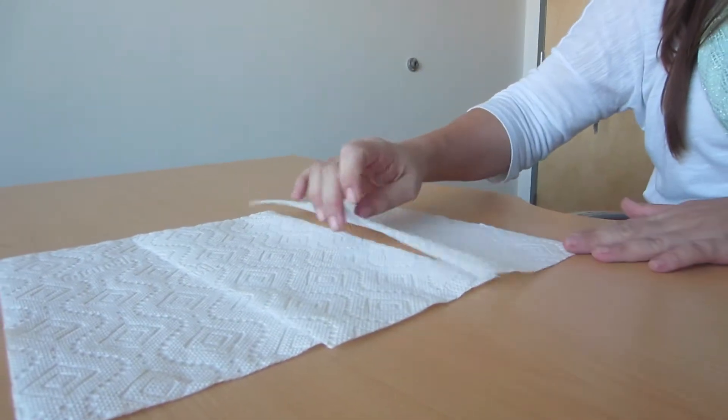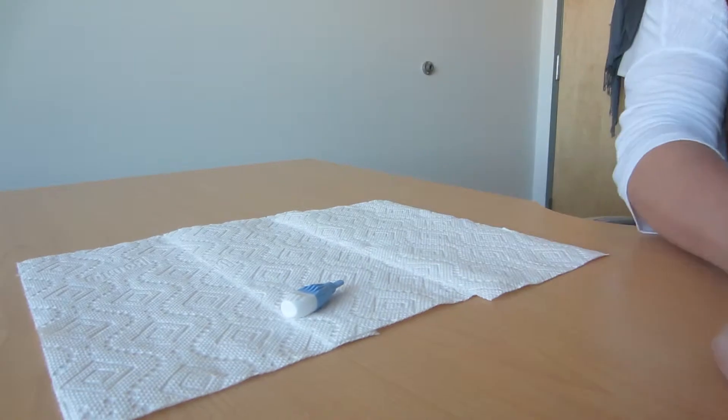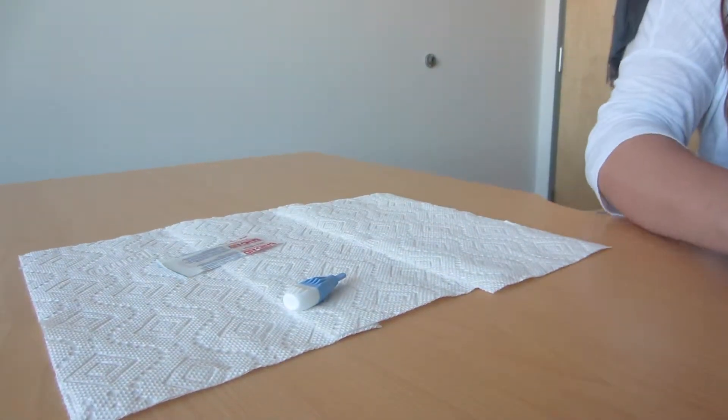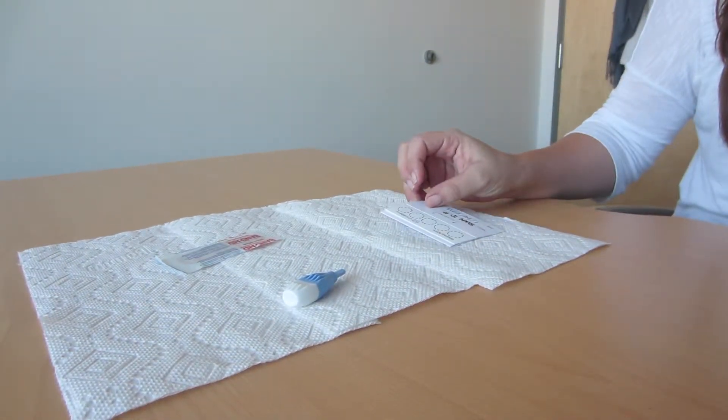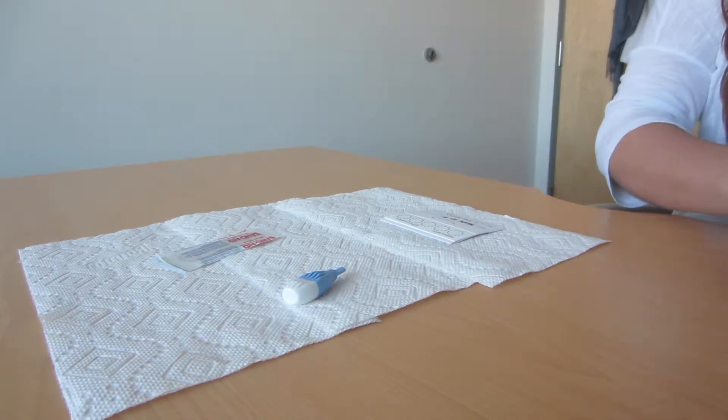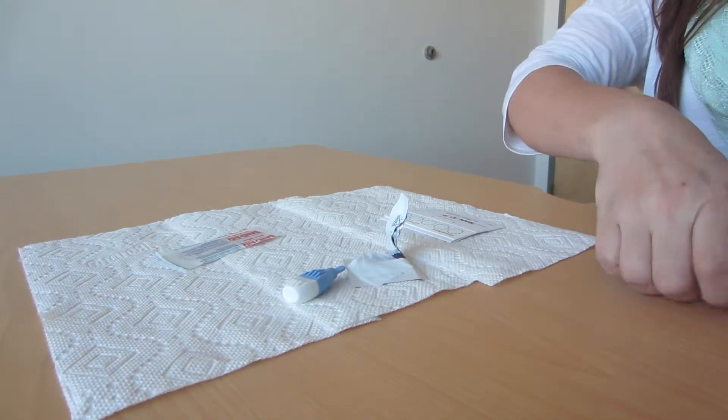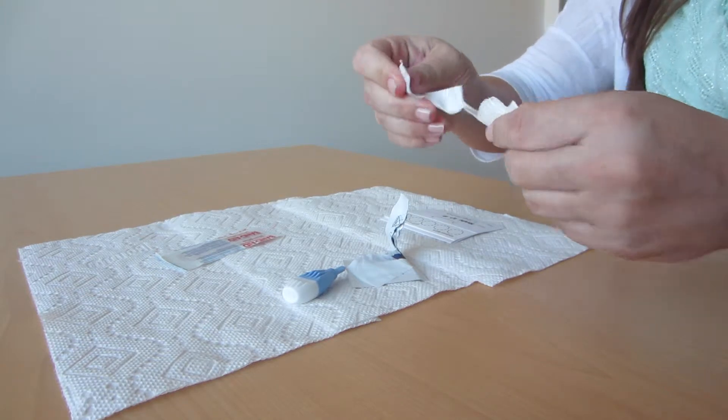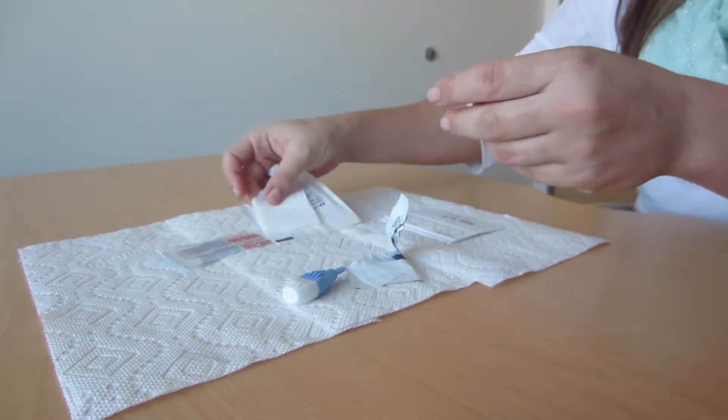Lay out three paper towels on a flat surface. Place the lancets, band-aids, and collection card with the circles exposed on the paper towels in front of you. Open and remove the alcohol wipe and the gauze pad and place them on the paper towels.